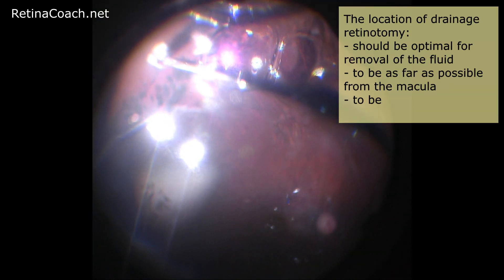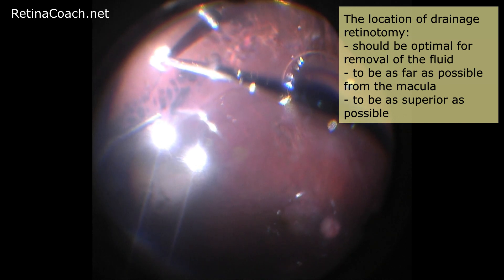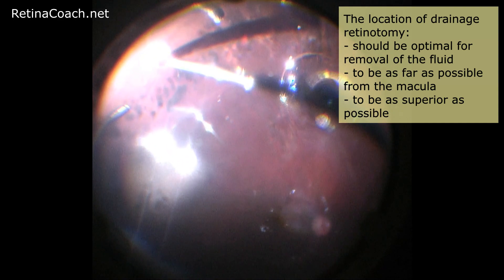The location of drainage retinotomy should be optimal for removal of the fluid — to be as far as possible from the macula and as superior as possible to allow good closure with an endotamponade at the end of the case. After retinal reattachment, the margins of the drainage retinotomy are usually treated with endolaser.